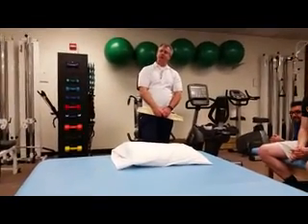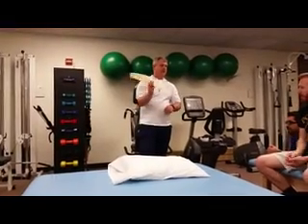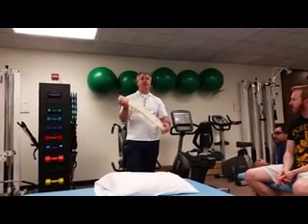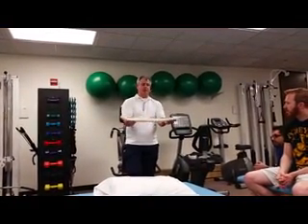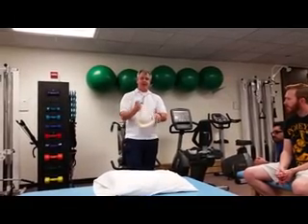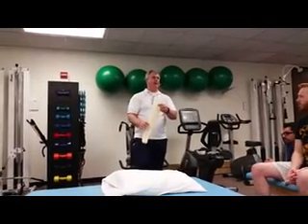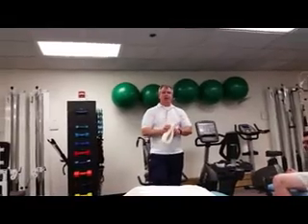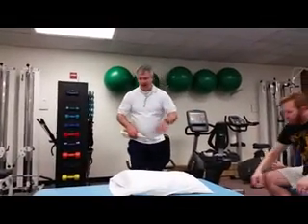Okay guys, so this is a soft collar. This one happens to have Velcro on the inside and the outside. Doesn't matter how you do it, I can go this way and it sticks, and I can go reverse this way. It's the same. Some of them have a Velcro strap that sticks out, so you have to make sure you do it one way, and if it's wrong and it's inside out, you have to turn around and put it on. So, Chris, since you're here, I'll just have you lay down on your back for me.